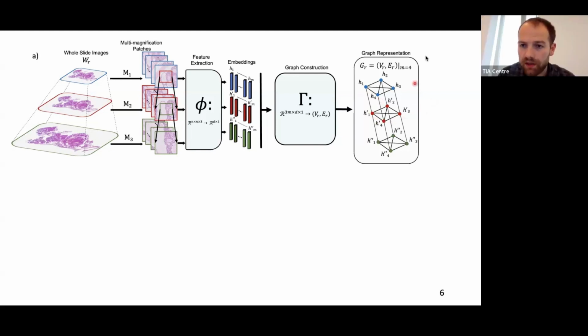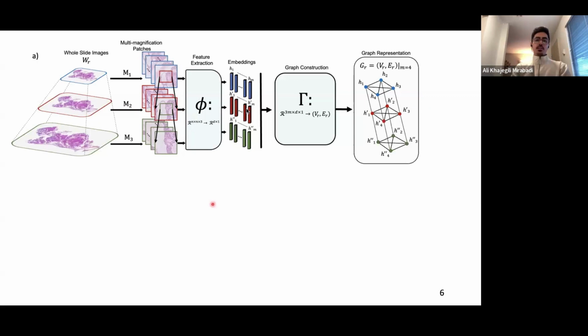Sure, thank you. And we also had a couple of questions or comments within the chat as well. So Tilak asked, what is the basis of magnification? Is it objective lenses? I think that's exactly what it is. Is it, Ali? Sorry, can you repeat? So Tilak asked in the chat, what is the basis of magnification? Is this objective lenses? So yes, I believe that is the case. Yes, it is.